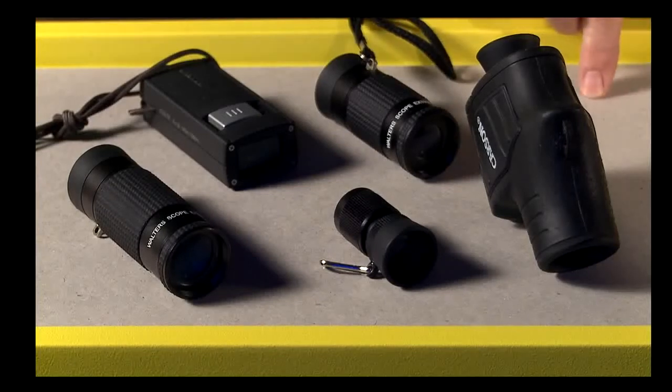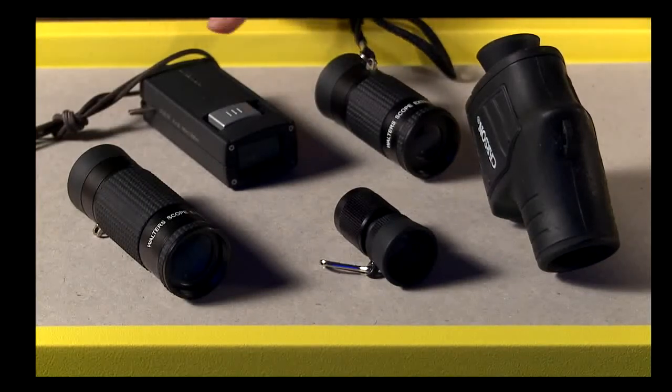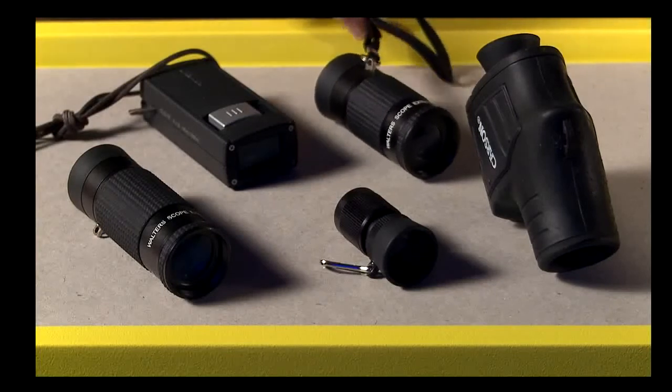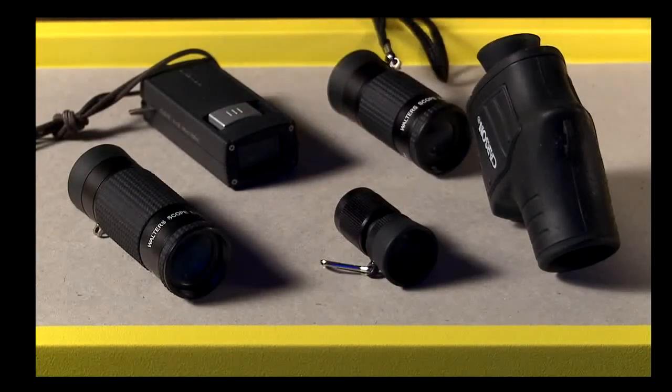These are some distance magnification devices. They're telescopes that are typically used by children and adults. Two of them are auto-focusing, so the user can focus them just with very simple movements. These other barrel telescopes are what you see a lot. Some of them have lanyards. I think on all of them you can attach a lanyard. And they come in different powers with different fields of view.